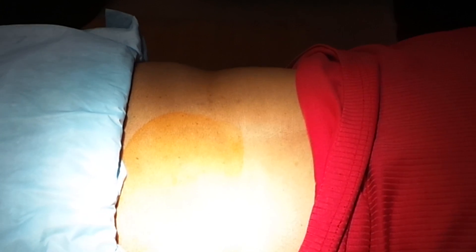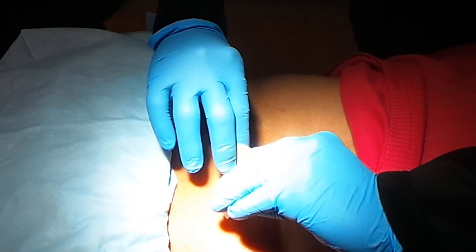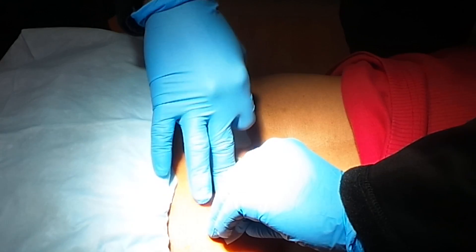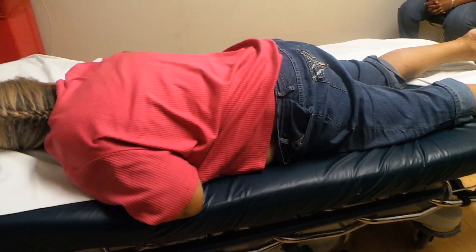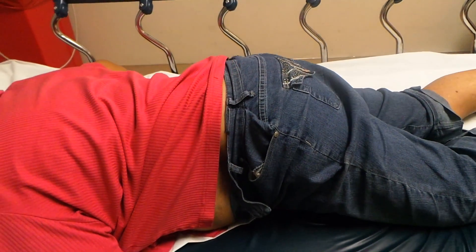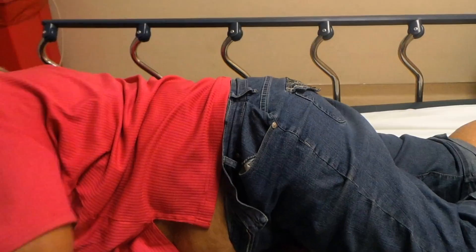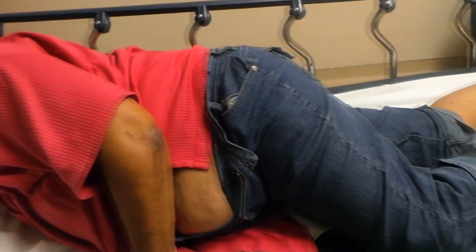And that's it. We're going to let her lay there for just a minute, then have her get up and move and see if she's made any progress. Let's go ahead and put a band-aid over that. It's just been two minutes. Let's see if we've gotten any of your pain relieved. Go ahead and start to turn over. Feeling a little bit better? Mm-hmm. It's feeling a little bit better.